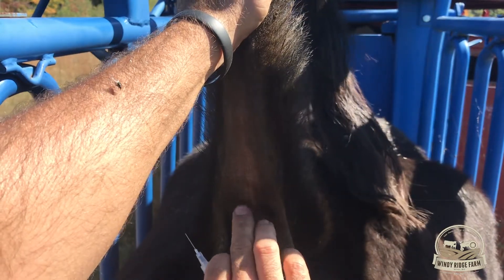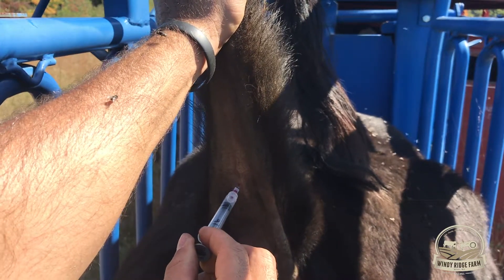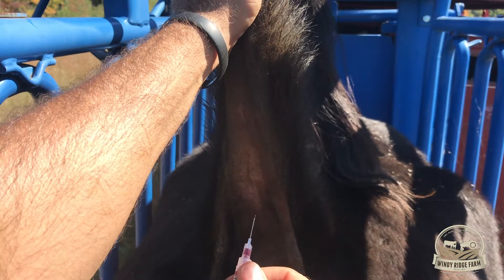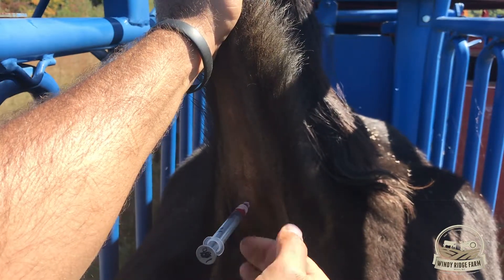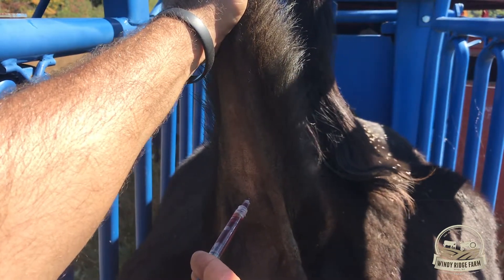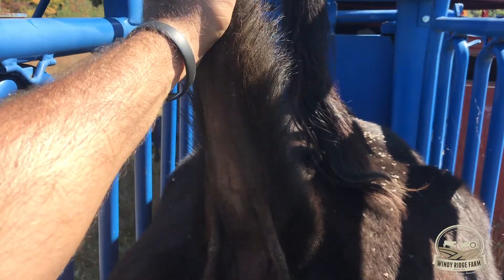It might take a couple of times to get it — some cattle are harder than others. There we go, draw back. And she's done, that's all there is to it. Got us three CCs, so we're good.